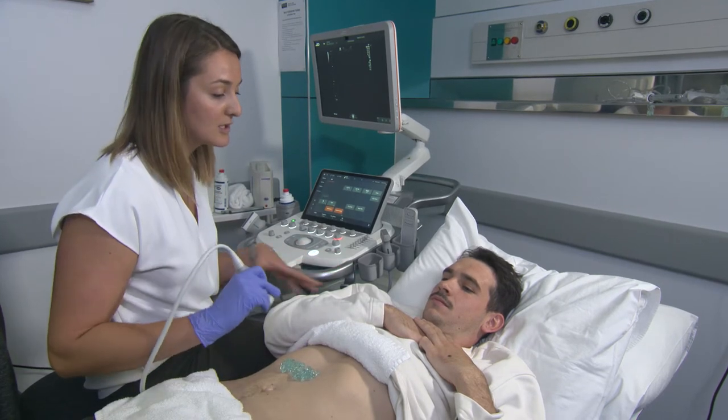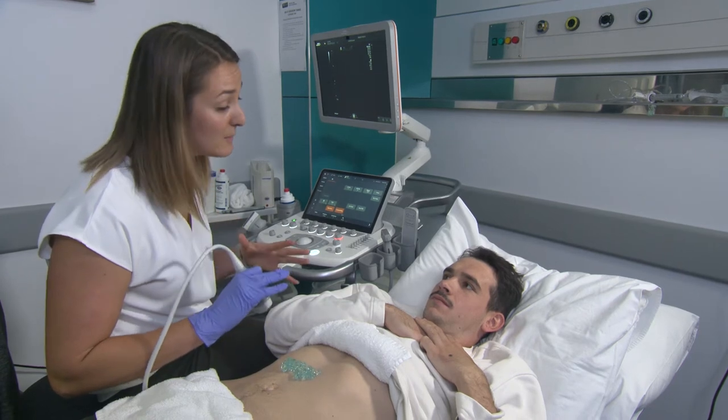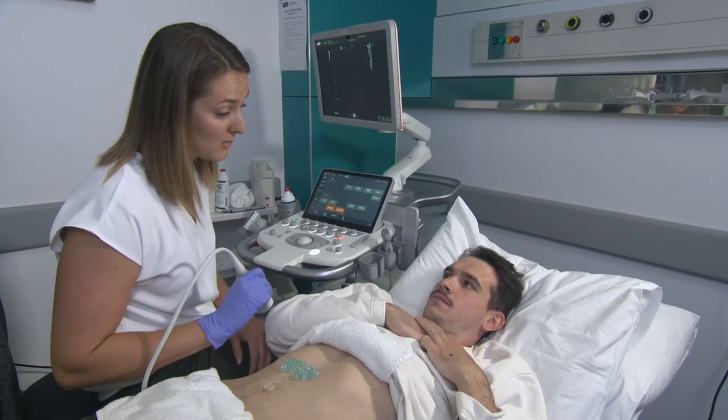The next thing I'm going to do is let the patient know that I'm going to start scanning. There's going to be a little bit of pressure, and if at any point the pressure is too much, just let me know.